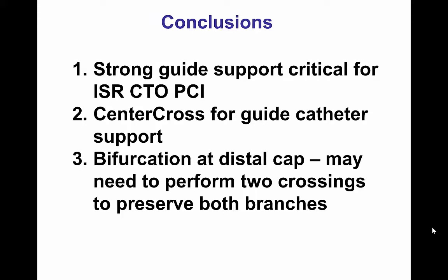In summary, for canalizing in-stent restenosis, having strong guide support can be very useful, especially since in-stent CTOs can have very calcified and hard-to-penetrate proximal caps. In this particular case, the CenterCross support catheter gave very strong support, allowing us to penetrate the proximal cap with a Confianza Pro-12 guide wire and achieve further crossing using various guide wires and microcatheters.